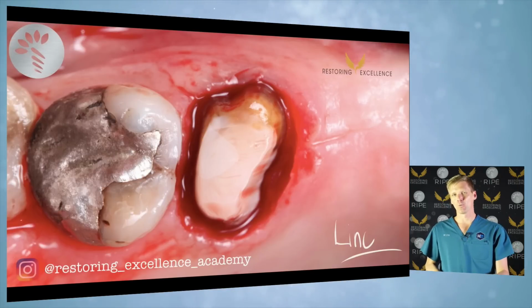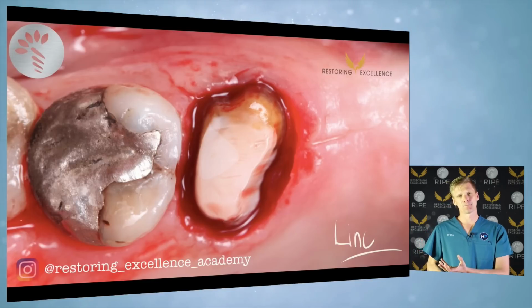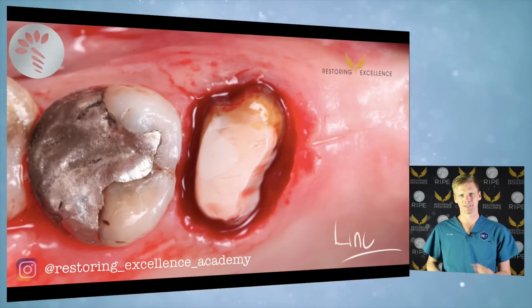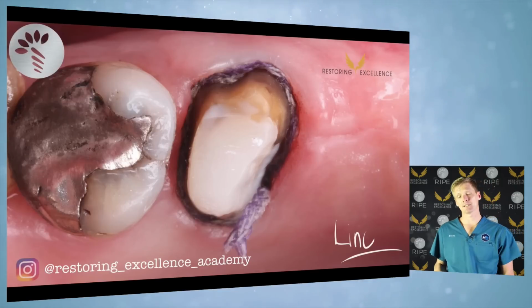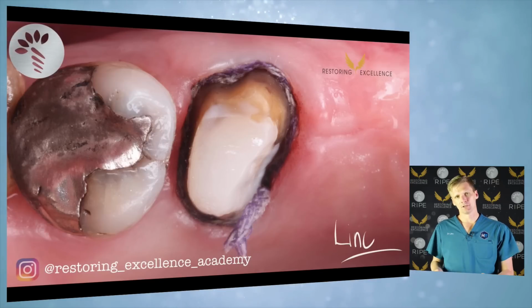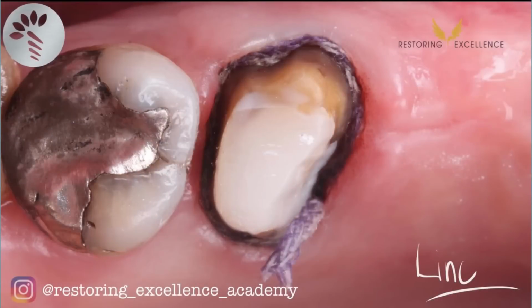You can put a temporary on and wait, but then the tissue will be delicate. So you'll need to wait for at least 6 weeks. And even then, if you pack a cord at that point, it can start bleeding again. So we may as well, if we can, take the impression now. There are some times when you can't, and if you can't take the impression, just put a temporary on and come back. So in this case, I've packed thin 000 cord, soaked in Viscostat, I've packed thick cord on top, and then I waited, and bang, impression first go.